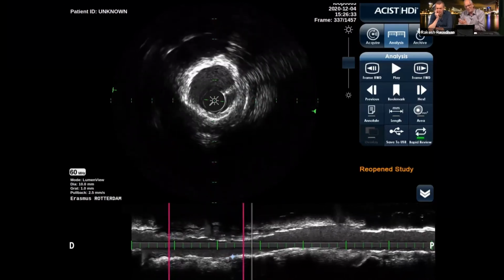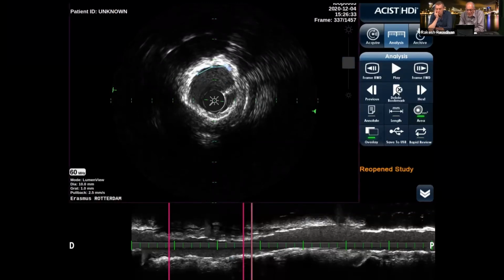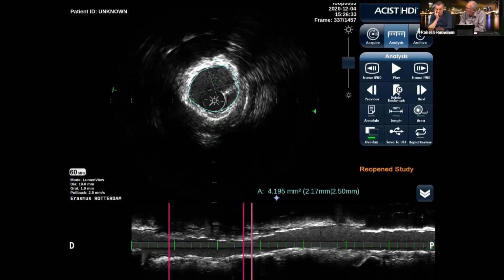So this is what we call the minimal stent area. Yeah. Maybe draw a short circle. I will make a short circle. See, you see that it hardly gave way. So that means that he implanted the stent in a napkin ring of calcium. We have 4.1, which for this big vessel is actually too small. And normally I would say you can push with your whole family against this. You'll never get this bigger because you have this big resistance of this napkin ring of calcium in there.